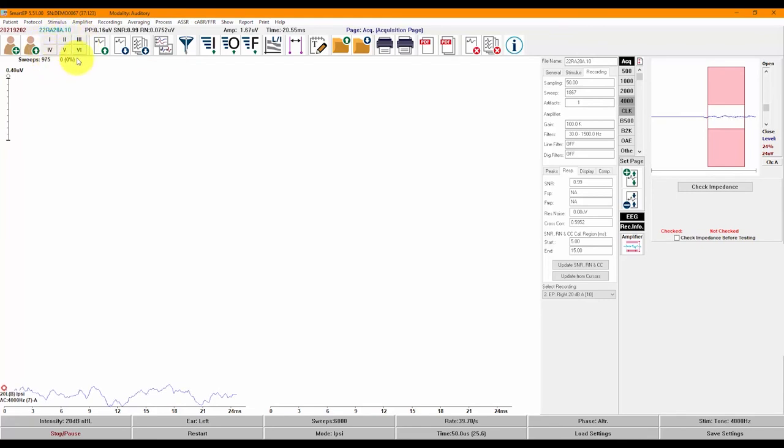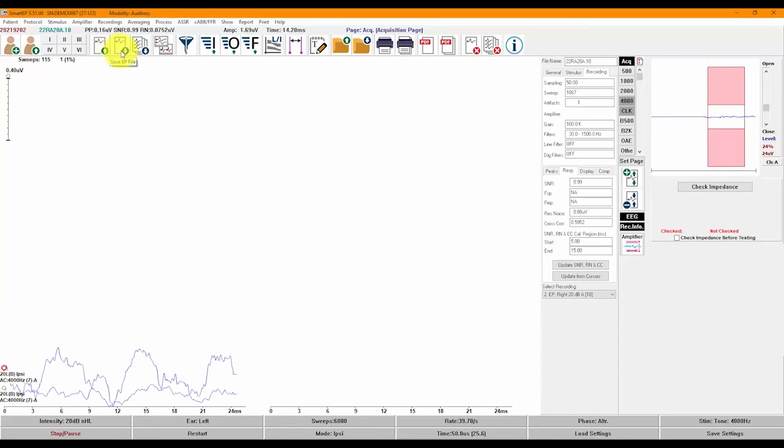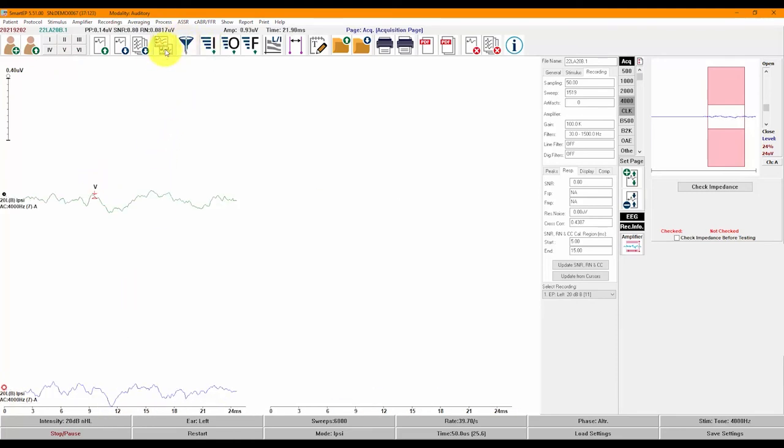Going from left to right on the toolbar: the left icon creates a patient file and the next one opens an existing patient file. Next are the peak labels for the type of auditory evoked potential being recorded — here in ABR mode, we have labels for peaks 1 through 6. The following icons allow you to load a recording, save a single recording, or save multiple recordings. All recordings are automatically saved upon completion, but these buttons allow manual saving of manipulated recordings. Next is a toggle between split page and full page display. The next button applies a filter such as a smoothing filter. The I, O, and F buttons quickly arrange recordings by intensity, order of acquisition, or frequency. Clicking I will overlap recordings that have the same intensity.